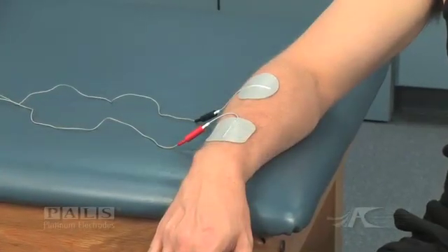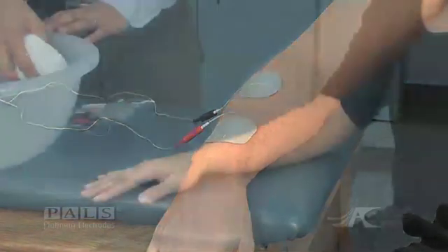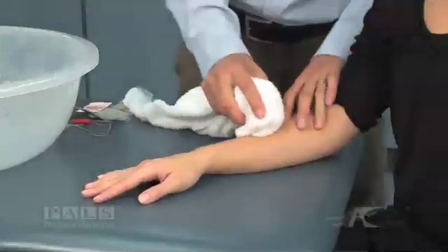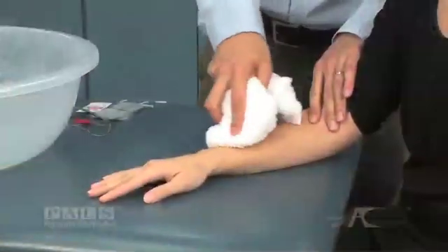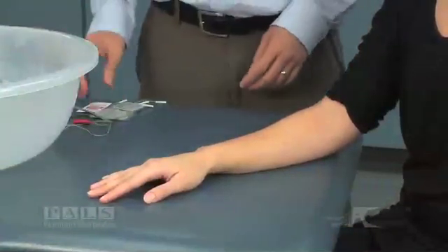Preparing the skin is a very important first step in preparation for electrical stimulation. You want to thoroughly clean the skin of any lotion, oils, makeup, and dead skin. You're going to do that with water for most patients, just using a towel, a wet towel, and cleaning the skin.